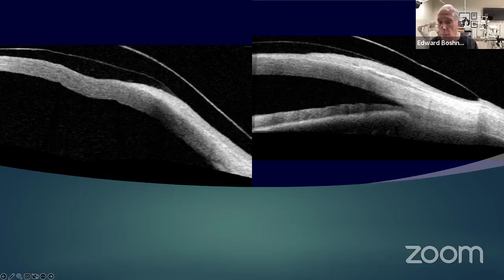Second question, how many lenses? Sometimes it's 1 or 2, rarely 1. It's sometimes 2 or 3. When there's complications, sometimes I may go 3, 4, or 5. It all depends on the person. I don't know if I'm answering the question. Everyone's different and unique. Sometimes you get a patient that's really easy, and sometimes someone you want to pull your hair out.